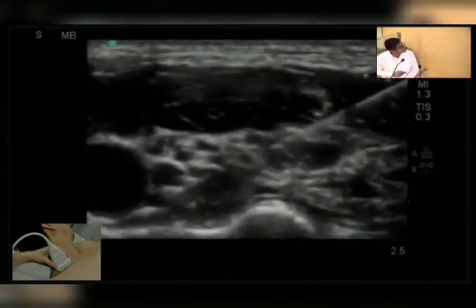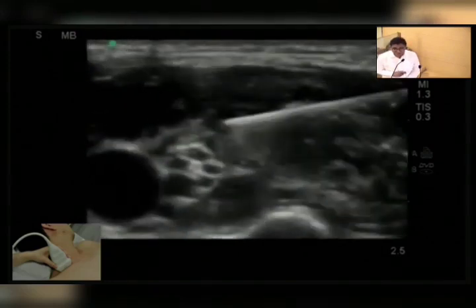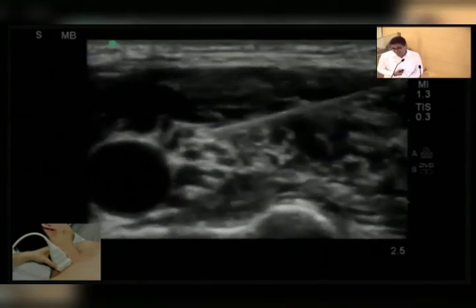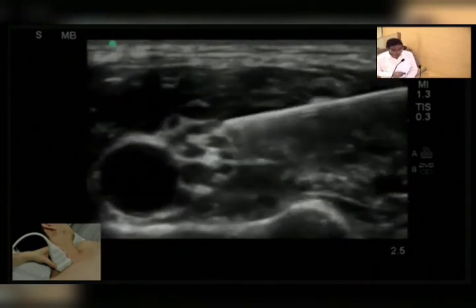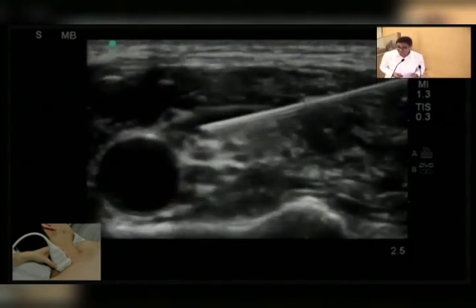and division. See, the 20 to 30 ml local anesthetic which I use in my practice, sometimes maybe more than that, but it all depends on drug distribution. So if the drug distribution is satisfactory, I may reduce the volume, but most of the time I use 30 ml.